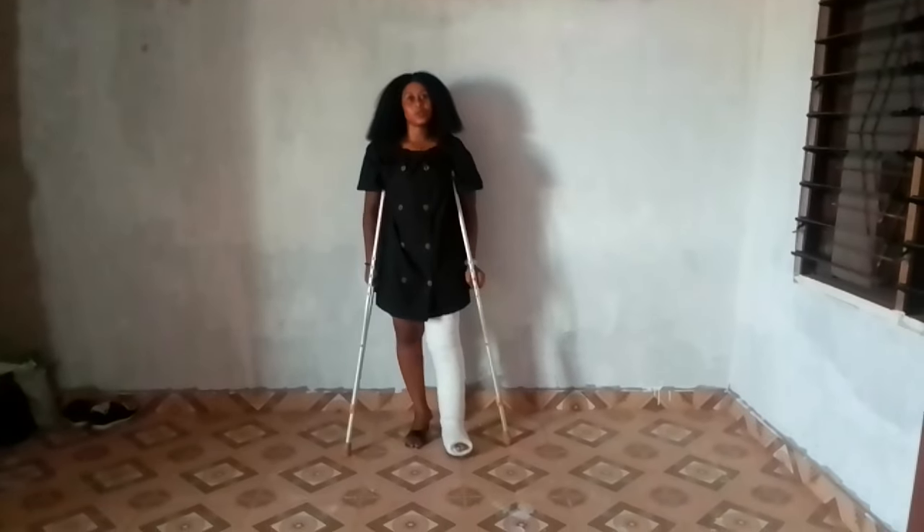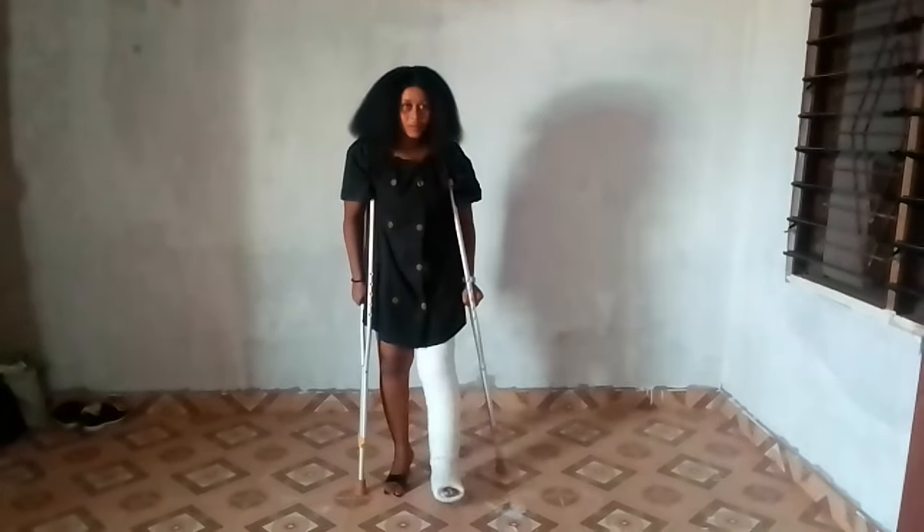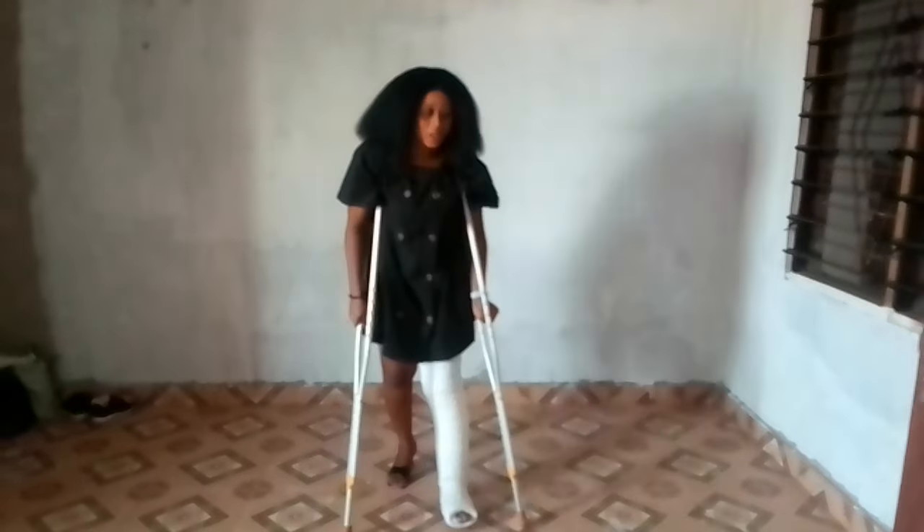Family, I am in a long leg cast, so I am coming to show you how I use it to go to work with the crutches. Watch now and see how I use it to go to work with the crutches. This is how I use it to go to work with the crutches.